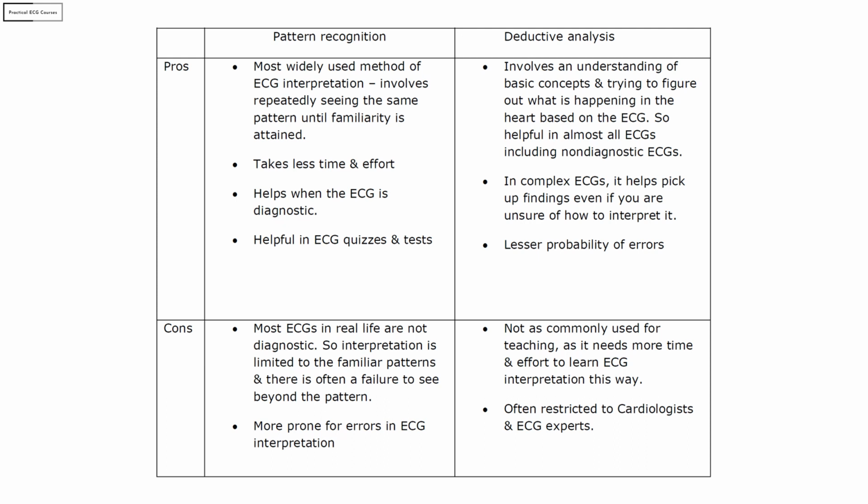The main reason why I did this session is because when I talk about concept-based approach, most people have no idea what I'm talking about, and they think it is some very advanced stuff being discussed which is not relevant in the ED. On the contrary, what we are doing here is actually delving into the basics and then laying the foundation for expert level ECG interpretation skills. This style of ECG interpretation gives you a level of confidence like no other because you then know the topic inside out.